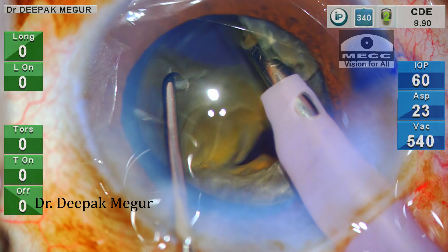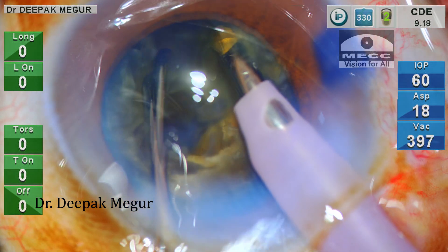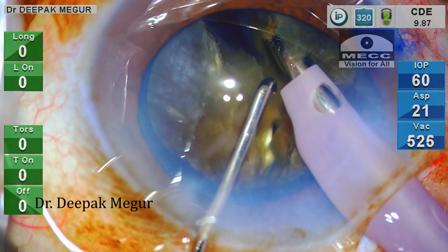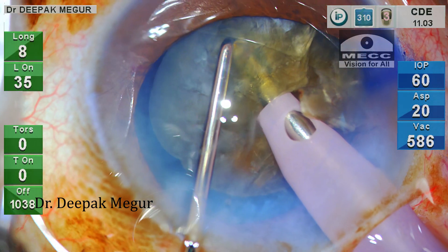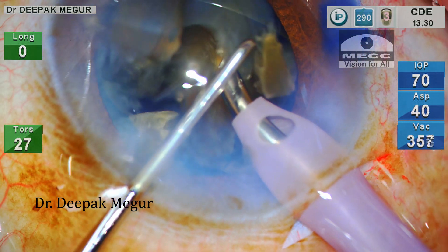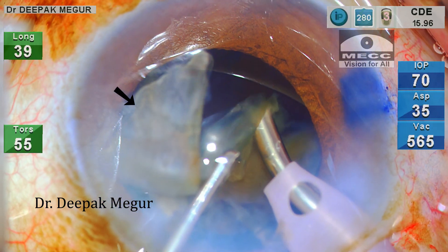Each of these hemi-nuclei is then chopped into smaller fragments. This case is a beautiful demonstration that having a bigger rhexis makes nucleus division and emulsification very easy, but at the same time has the disadvantage that nuclear fragments not being emulsified at that particular moment can still come out of the bag because there is less of a barrier effect, and these free-floating nucleus fragments have an increased chance of hitting the endothelium.